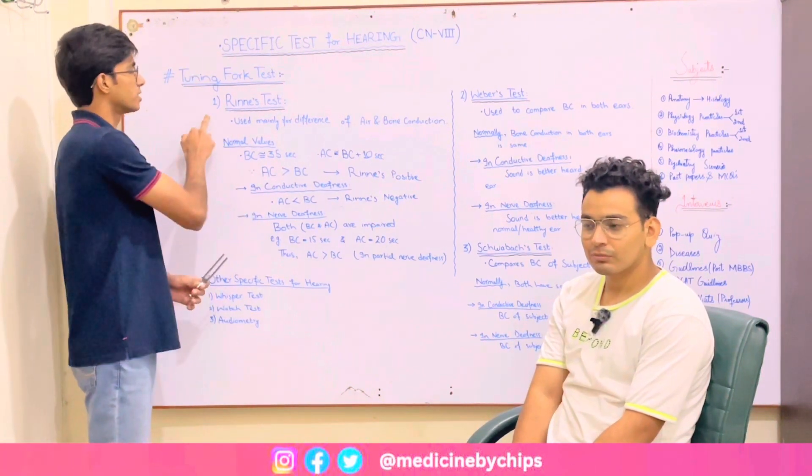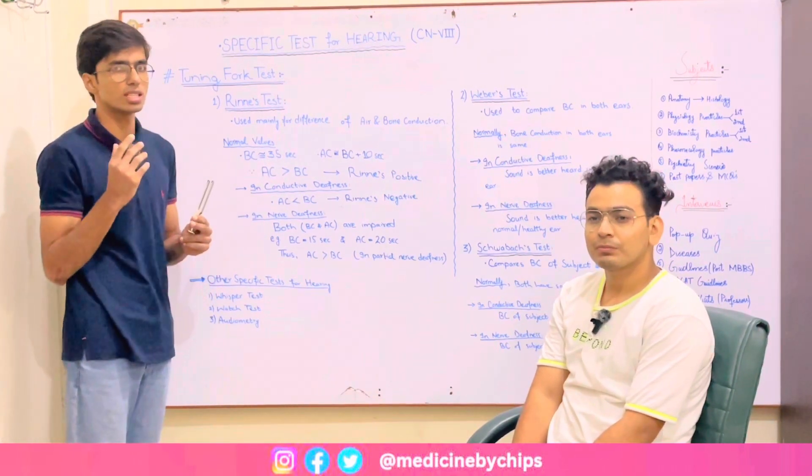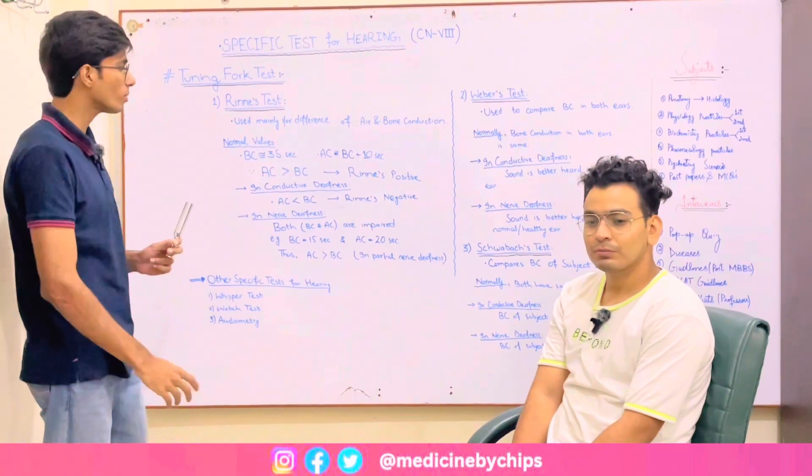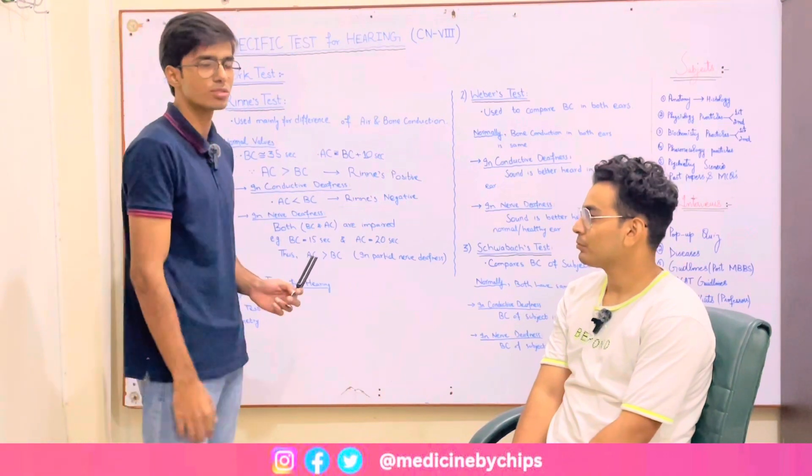First of all, Rinne's test. Rinne's test is used mainly for understanding the difference between air conduction and bone conduction. We have a subject here and I will demonstrate it for you.